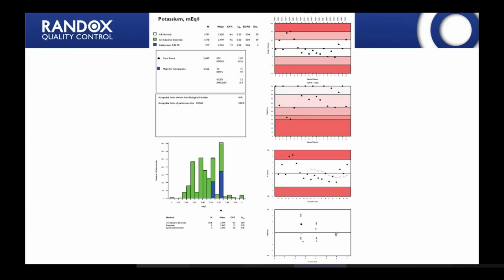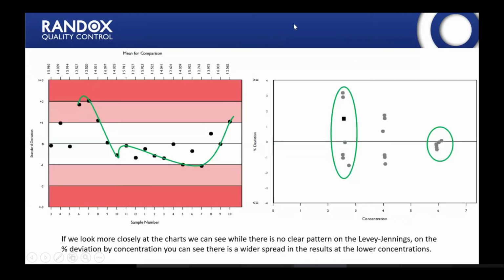So we're going to look at some of the other charts on the report and see how we can identify some different issues on the reports. We have our report with all our different sections that Stephen has gone through, and we can see some differences here. If we look at the Levey-Jennings chart, we can see, I had fun drawing this line, that the performance decreases here, and then it goes back up, and then they run the negative bias for a little while, and then it goes back up again.